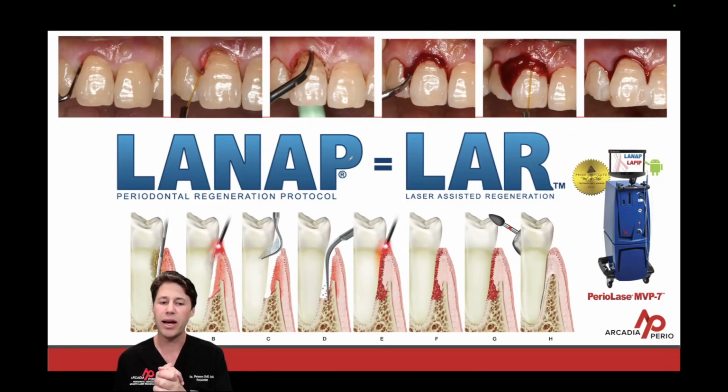And the other thing too is when we're using the laser, there's different power settings in terms of when the pulse durations are different. So the peak powers are different per different pulse duration. So even though the average power may be 3.6 or 4 watts, when I'm at 100 microseconds, remember when my foot is on the pedal, the laser is still off about 99.8% of the time.